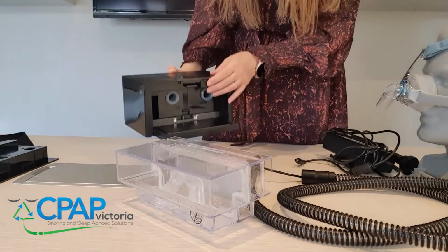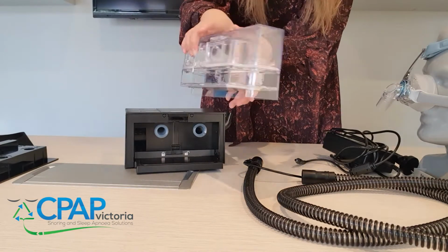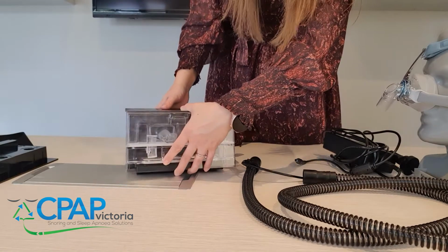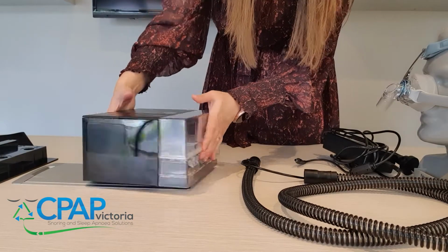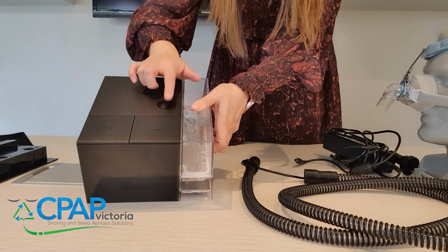The water chamber has the heated plate that needs to go against the heated plate for the humidifier, and it just slides in like so. When wanting to release or remove the water chamber, you once again need to press that round button on the top to slide it out.